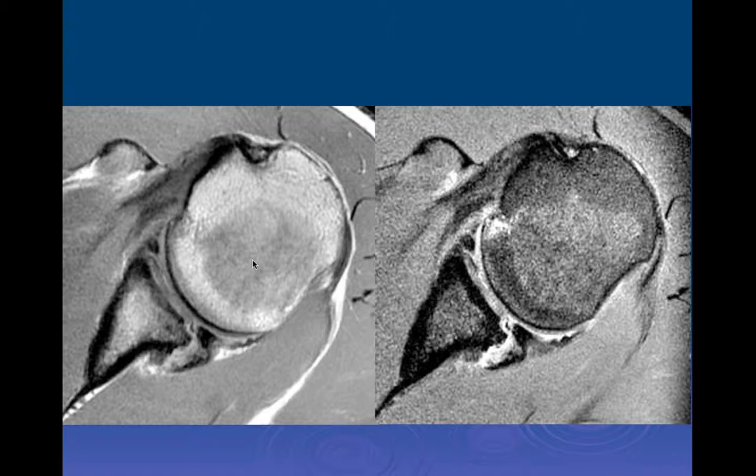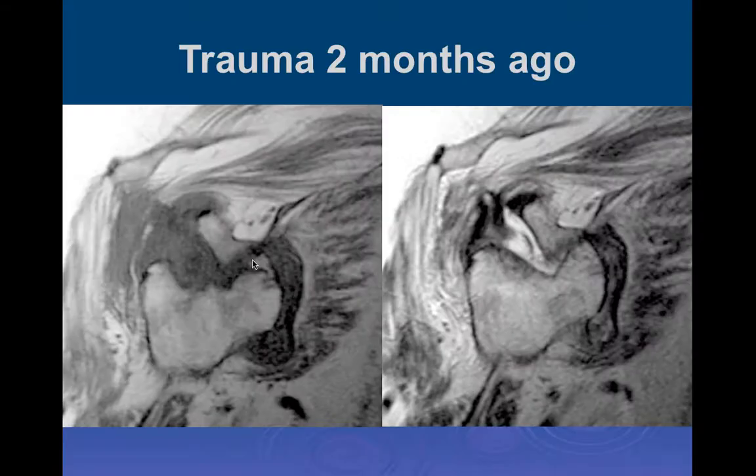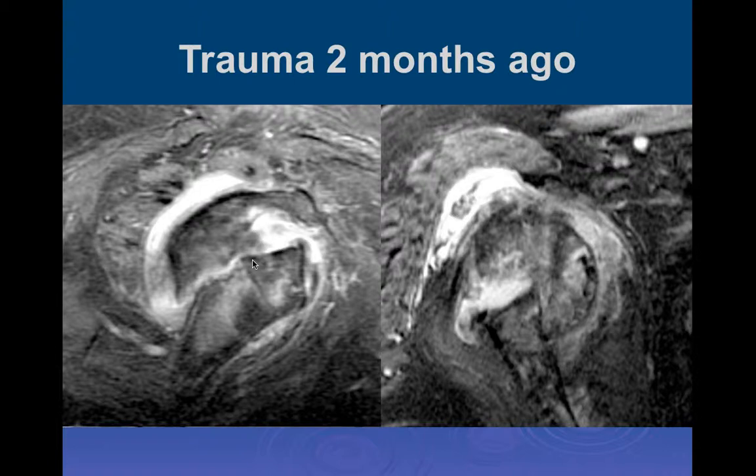Yep. Person very, very chunky. Yeah. Ouch. Oh my word. It almost looks like there's a fracture through that posterior dislocated humeral head, a fracture line. This patient probably is also very osteoporotic, making the bones more susceptible.